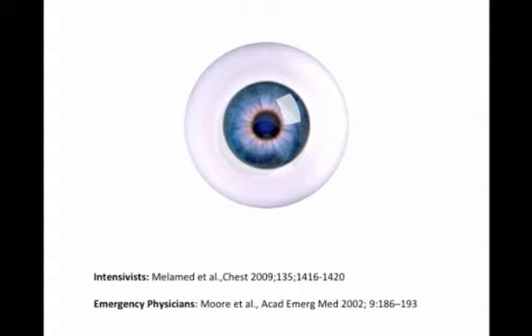That is, just looking at the ventricle, either in the parasternal long axis or the parasternal short axis, or ideally both, as well as other views if you have them, and determining if the ventricle is functioning well, really well, not well at all, or terribly. And this approach has been endorsed and studied by both intensivists and emergency physicians, and it's shown to be quite accurate.